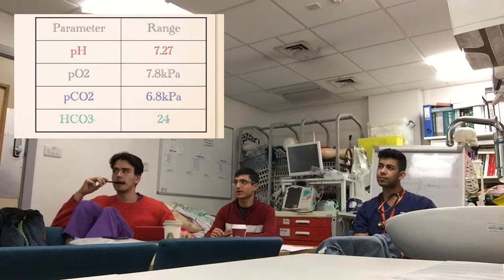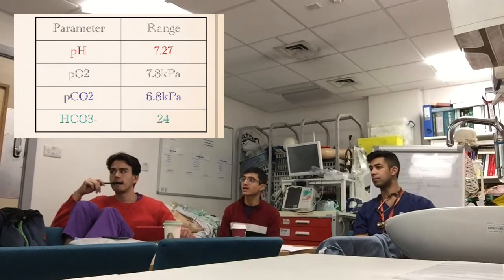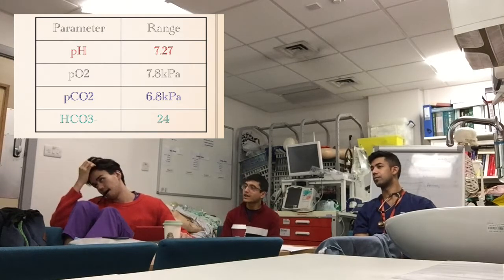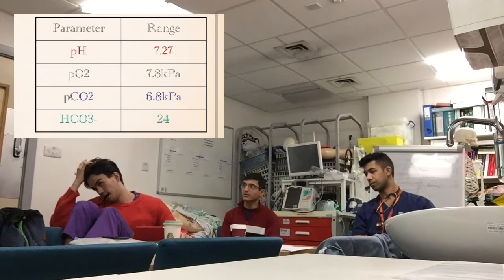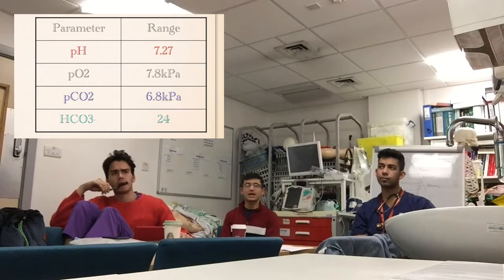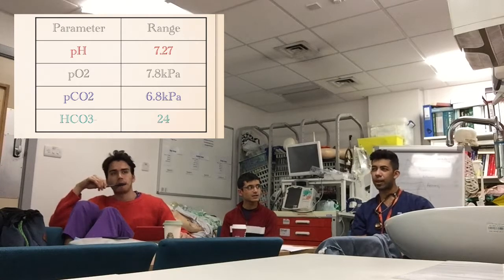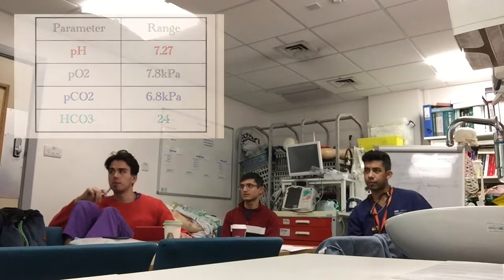So the pH shows acidosis. The carbon dioxide is raised, and the base excess is within normal, and also hypoxic. So respiratory acidosis and hypoxia, type 2 respiratory failure. Okay. Do we agree? I'm getting yeses. Okay. All right.